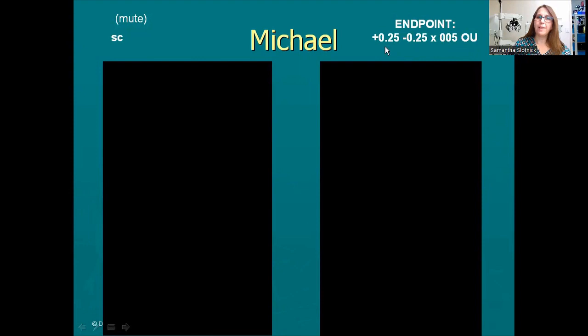But what the components are here, we move in quarter steps of power. So this is the smallest amount of power in the sphere component. And then you could see minus that same amount of power in the cylinder component. So the net power is 0 in one meridian and actually plus a quarter in the other meridian. And so this is the smallest kind of prescription one can write using just basic spherocylinder prescription writing.